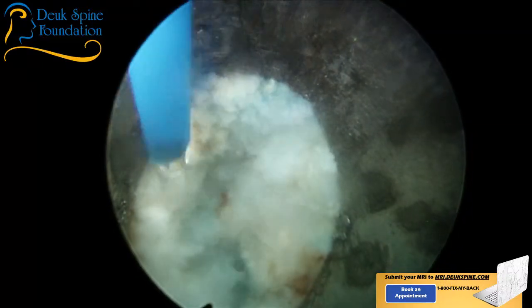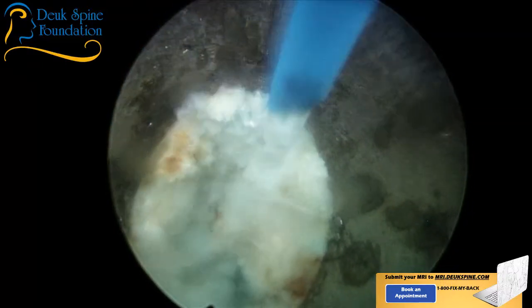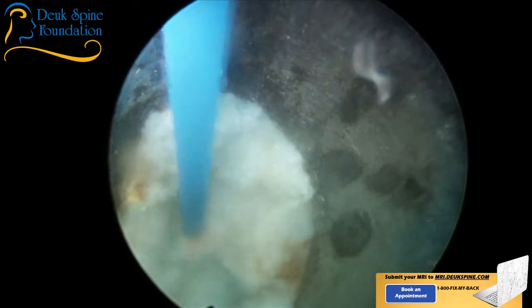This is the laser, the blue thing, and I'm cleaning the tear, cleaning up the tear.